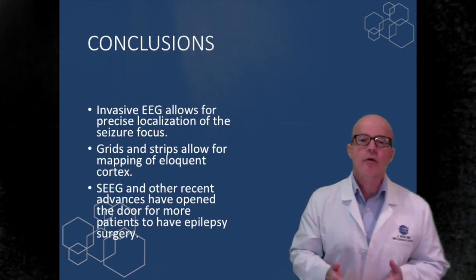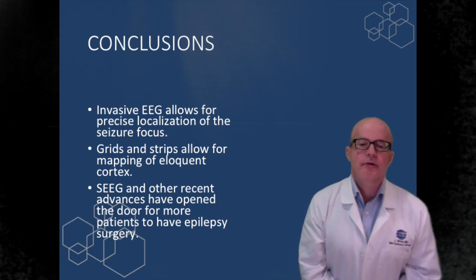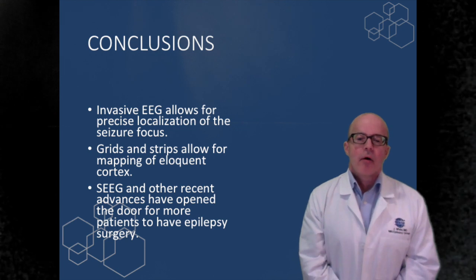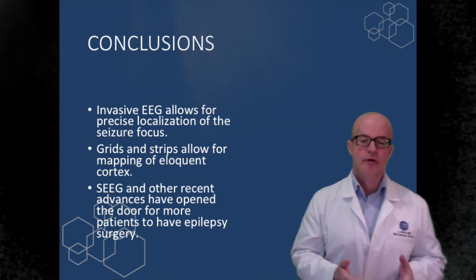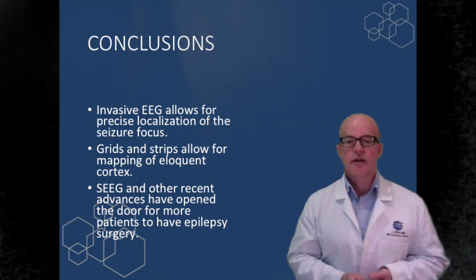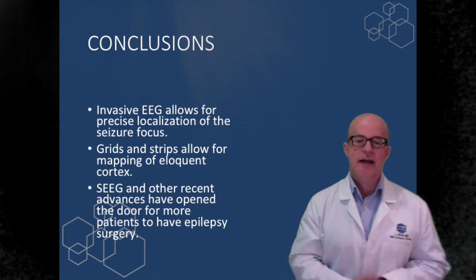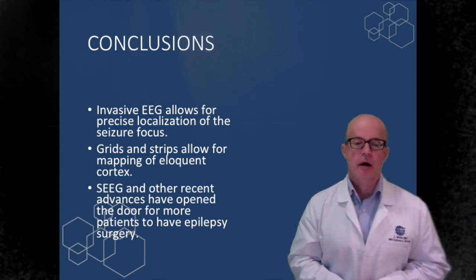So in conclusion, I would just like to say we at the Minnesota Epilepsy Group are very excited about all these new surgical options for our patients. More of our patients with intractable epilepsy are getting more options, and the invasive EEG options, including this SEEG, are really expanding what the options are.